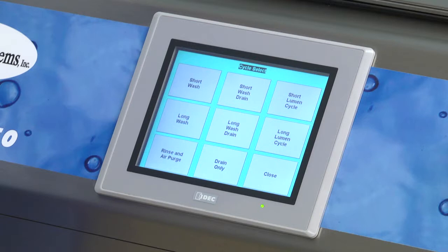From this menu, you can choose from two basket cycles. The short cycles have an 8-minute ultrasonic duration and long cycles have a 13-minute ultrasonic duration. Short Wash and Long Wash will wash but not drain for times when you want to conserve and reuse water. Short Wash Drain and Long Wash Drain will drain the basin after the wash cycle.